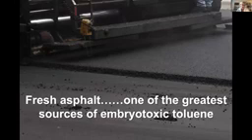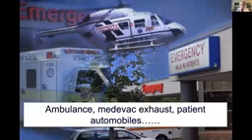But fresh asphalt, whether it be resurfacing a medevac pad or resurfacing a road, repairing a rooftop adjacent to you, again, very common outside activities that are outside of the control of the IVF laboratory. Our laboratory was based at a level 1 trauma center. So we had 8 medevac helicopters, idling ambulance engines.